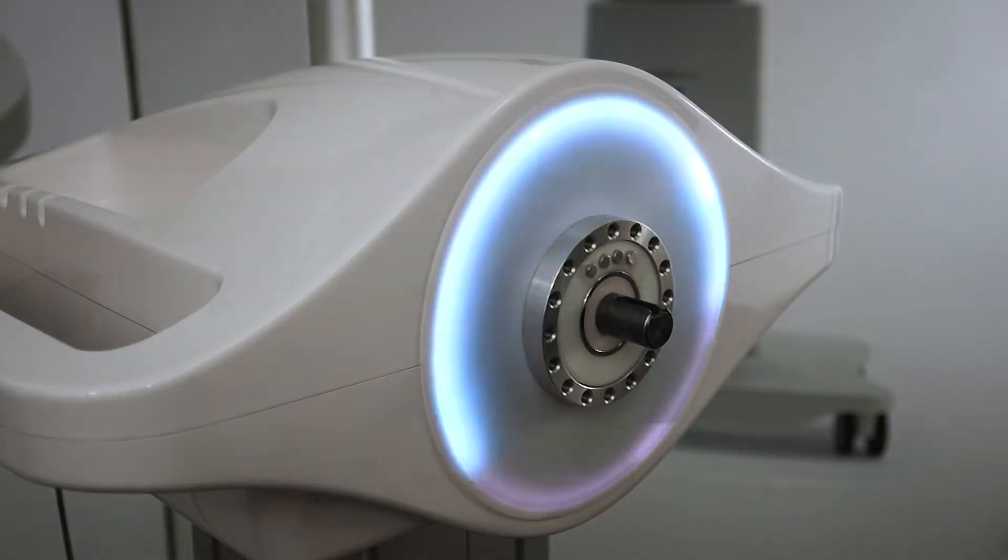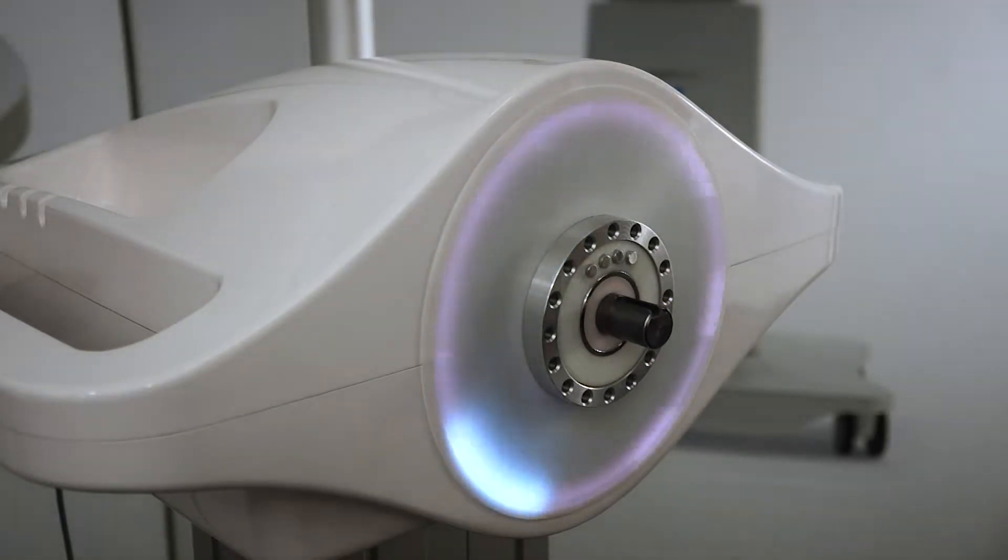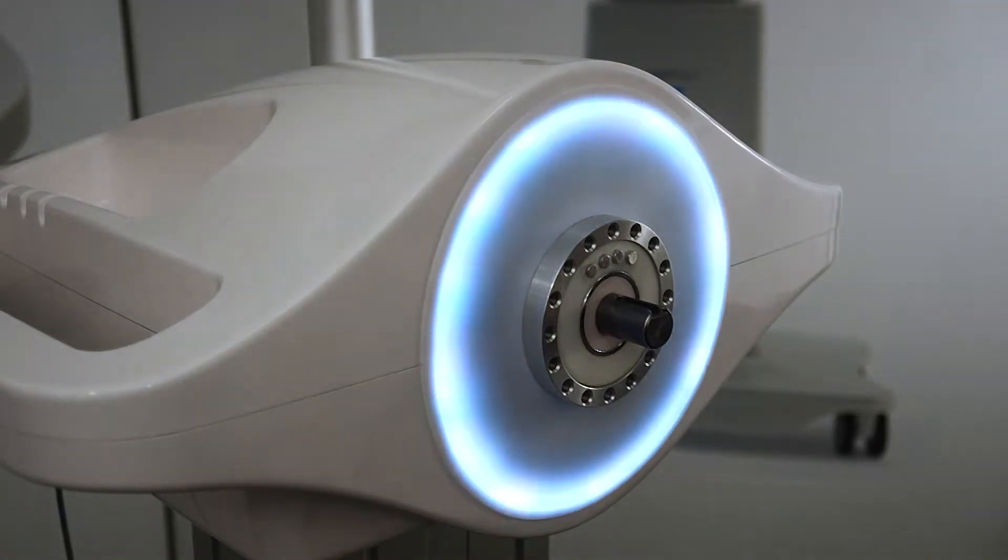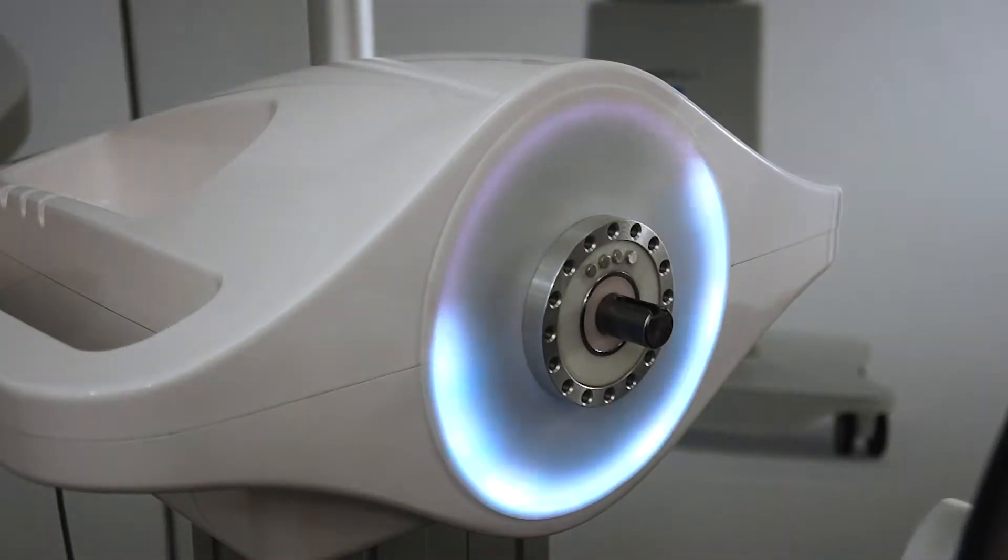While connecting the extensions, make sure that Luna's shaft with the key is in the upright position. That means it's fully calibrated and ready to get the extension connected. Each extension has three steps of putting it in and connecting it to Luna.